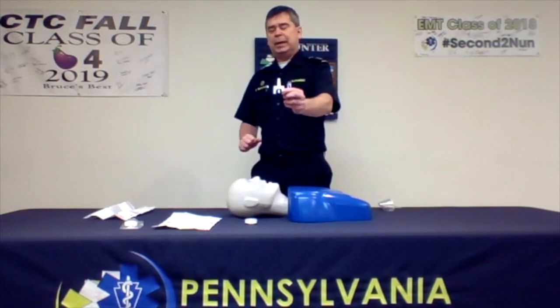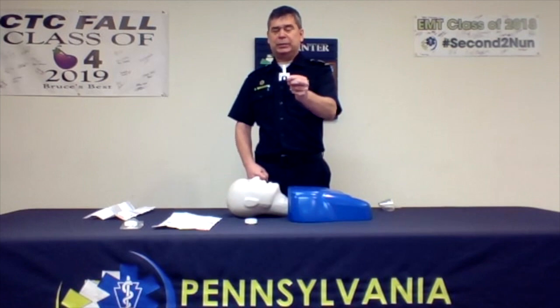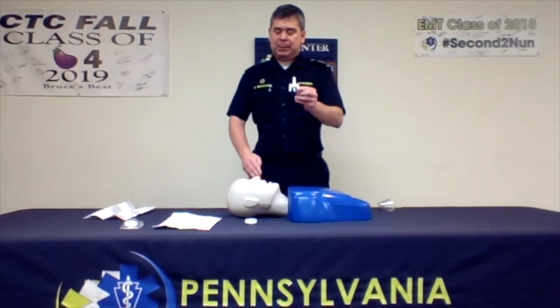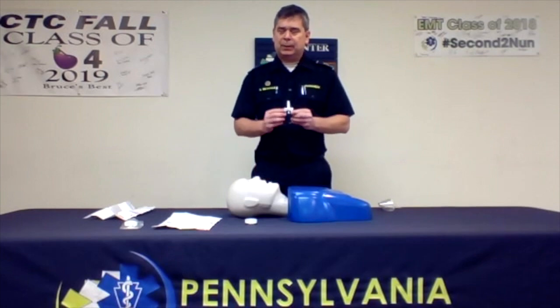The nasal Narcan cartridge has no needles and is not a sharps consideration. It is a 4 milligram dose of Narcan, which is given intranasally, meaning that we must put the applicator into the nose or the nostril of the patient.